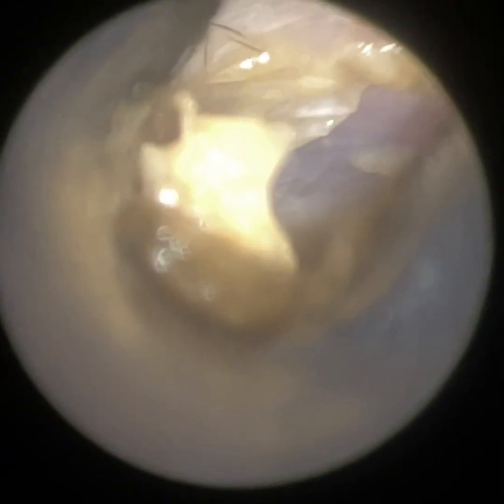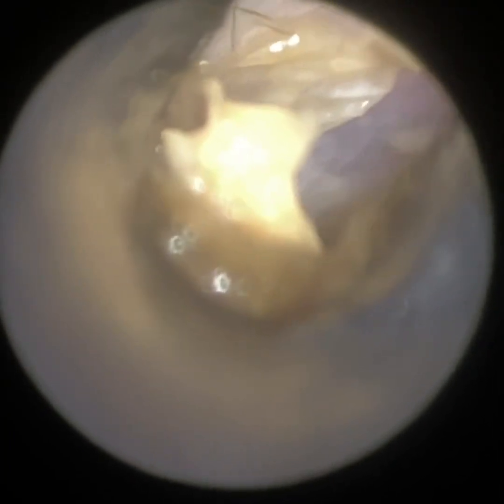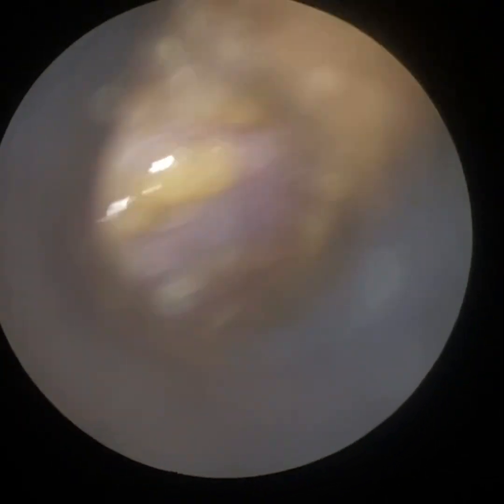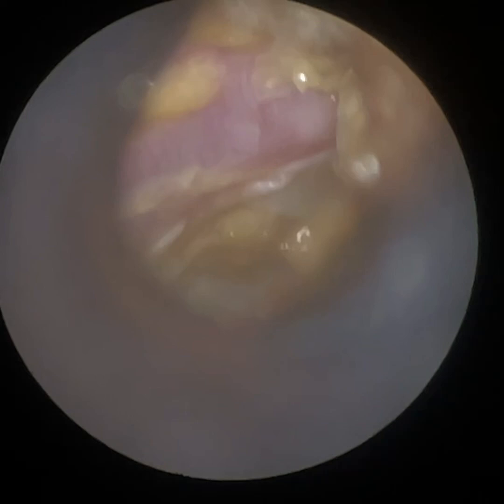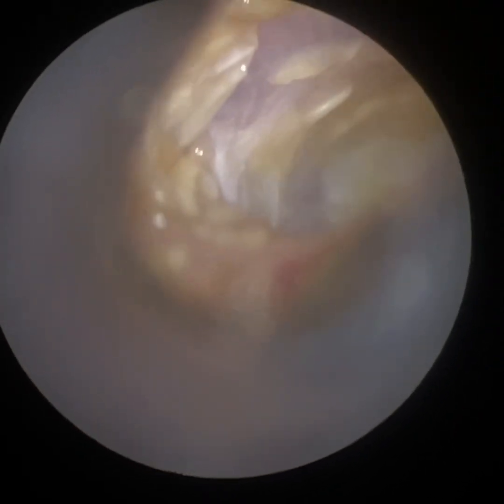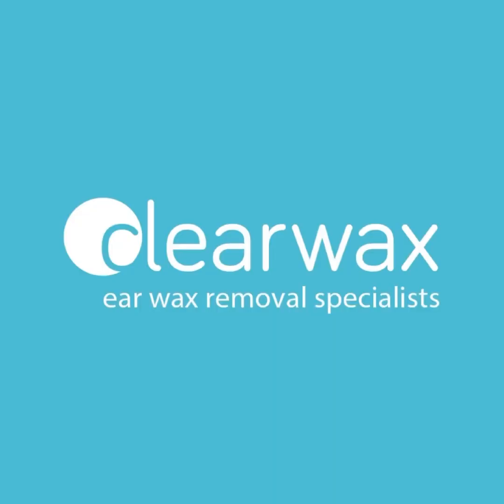There's just a bit of soft wax here near the entrance — I just want to get this out for the patient. We've managed to get everything else out. The patient's father had been instilling some sodium bicarbonate drops, which made the ear really wet and gooey. So there is some residual wax here. It's really hard just to examine the ear, but with the Waxscope it's a lot easier. There is some residual wet wax, but it's not occluding the eardrum.